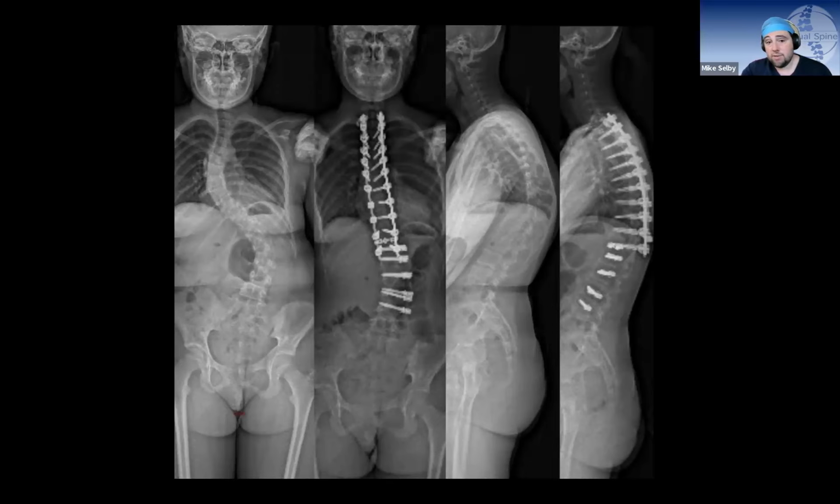No, and I do think in some cases it could be helpful. You're using a lot of fluoro. I mean, you've been there when we've done these cases, where we're at several hundred fluoro shots, which isn't great for us, right? The patients are probably okay. They're snapshots, not continuous screening. But it is something that I do think navigation can certainly assist with in the future. Good question.